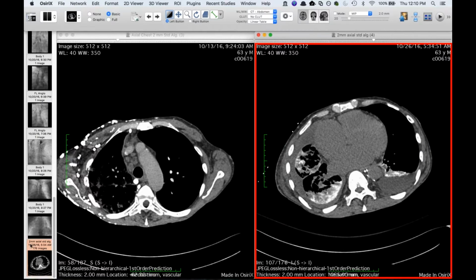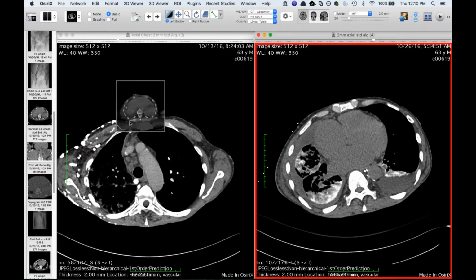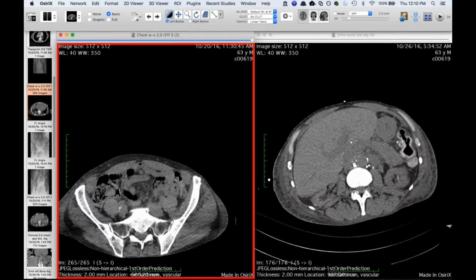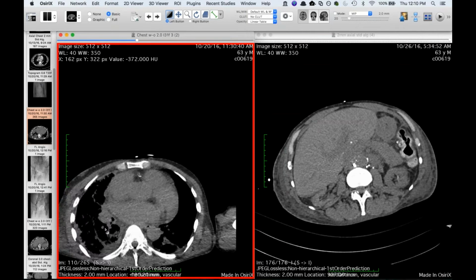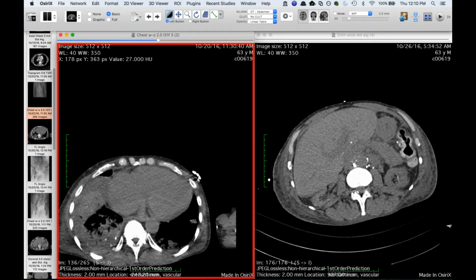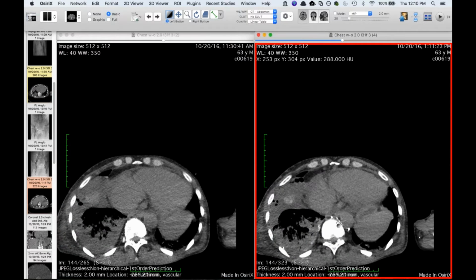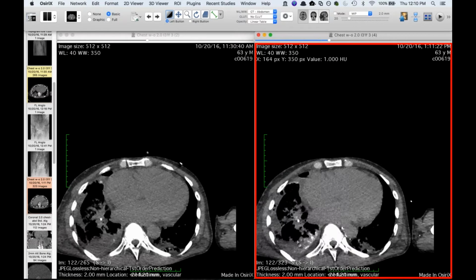But what's fascinating about this high attenuation in the lung, this is the CT from the embolization, the lymphangiogram that they did, and you see at the start of the procedure that the lung looks exactly like that other CT, with all of this congestion and crazy paving, and the attenuation of the lung isn't really that impressive. That was done on the 20th, and here it is 2 hours later, and this is during the middle of the procedure, and check out what the lung looks like now. It's starting to become higher attenuation.